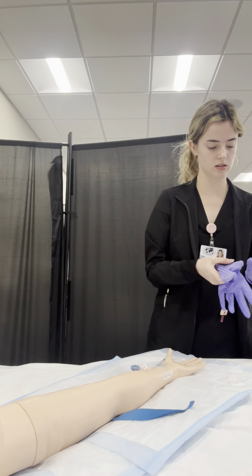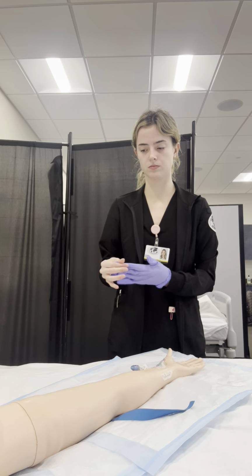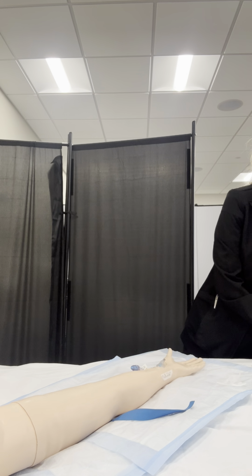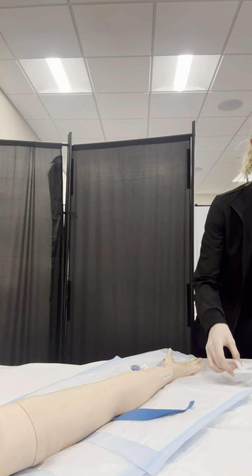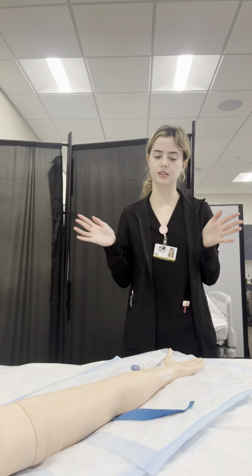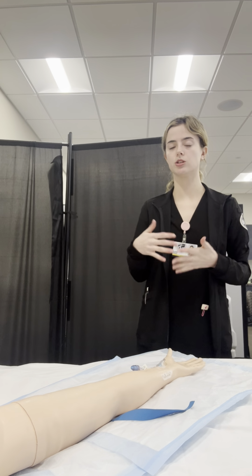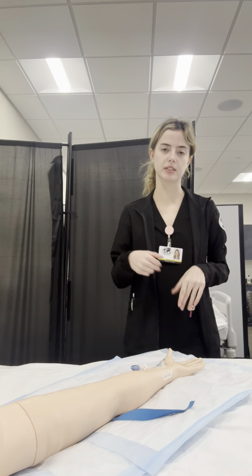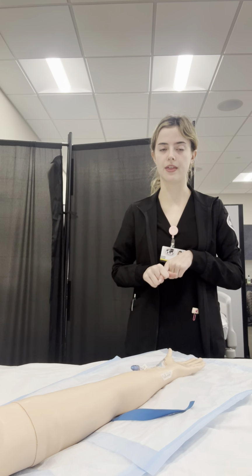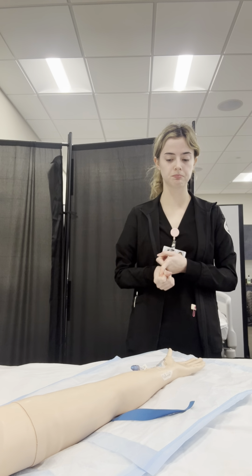Now, I'm just going to use the same set of gloves. Okay, so now let's just say it is 3 days later. So the provider has ordered to discontinue the IV. So same steps as before. I'm just going to verify that the provider ordered to discontinue the IV on my patient.